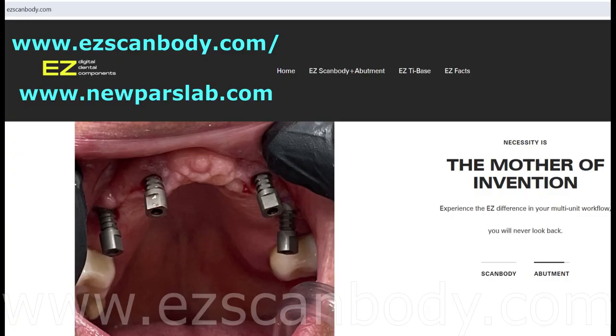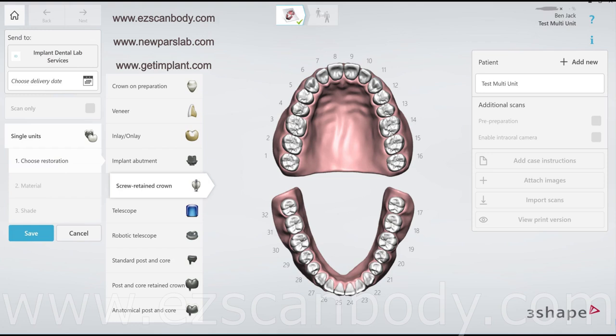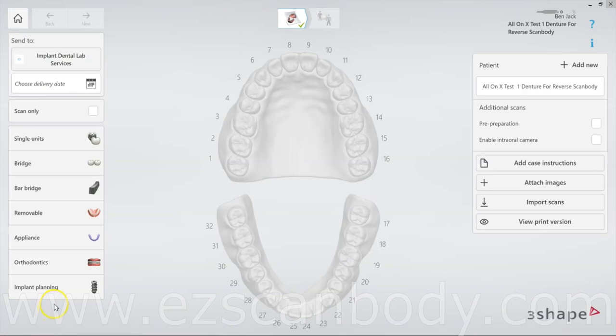Welcome to this step-by-step guide on scanning an all-on-X implant case using HCAP ScanBody from Implant Dental Lab Services' T3 Shape Scanner. Whether you're new to digital dentistry or looking to refine your technique, this video will walk you through the process of achieving precise and reliable results.